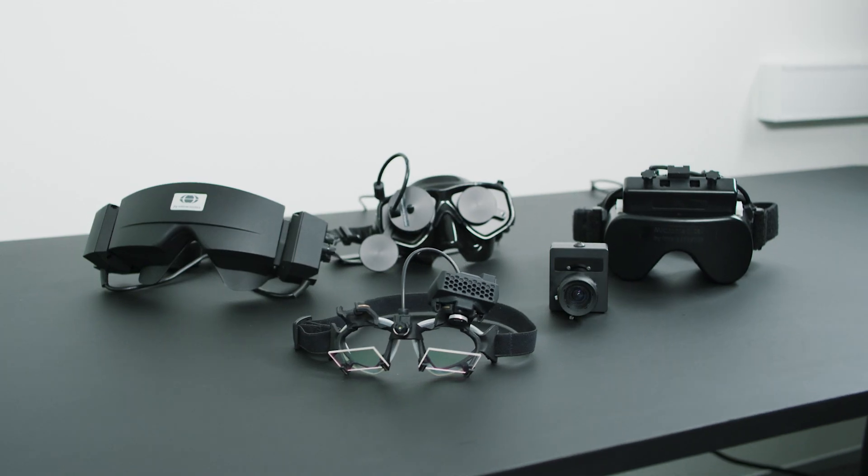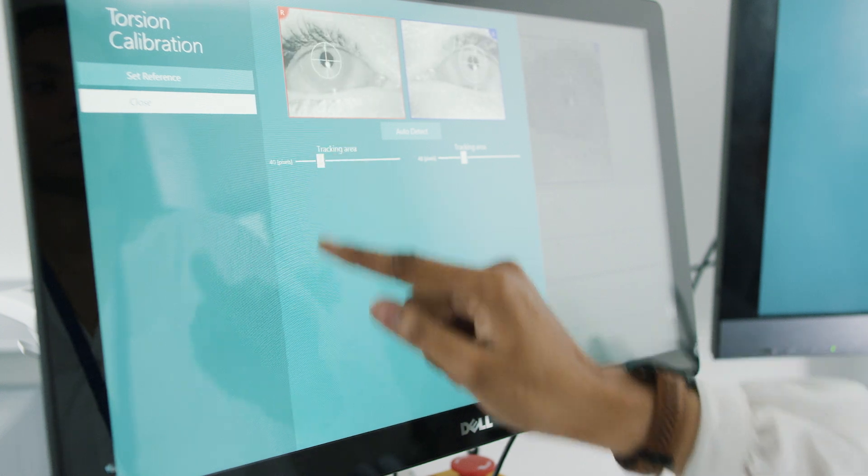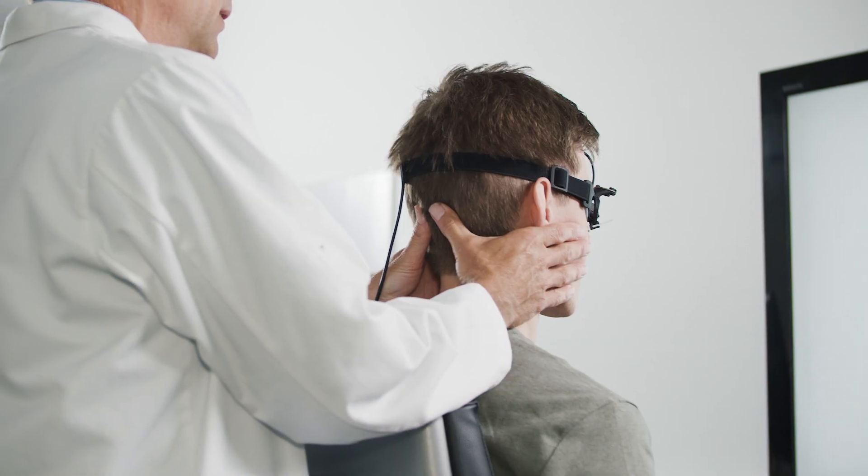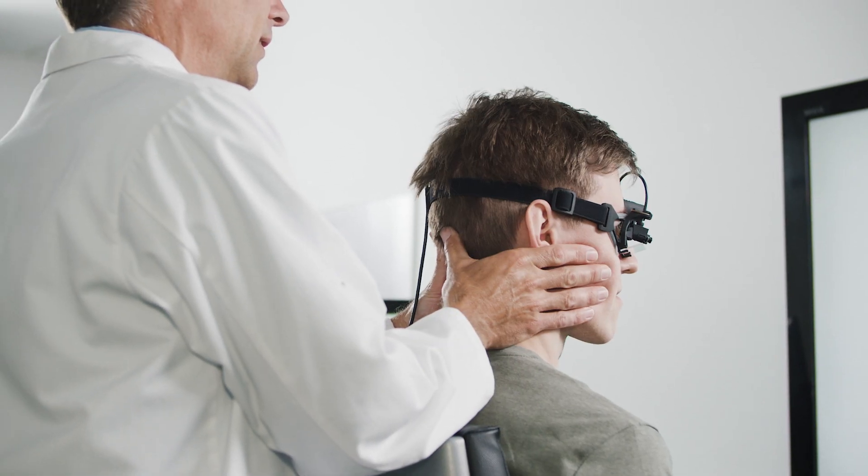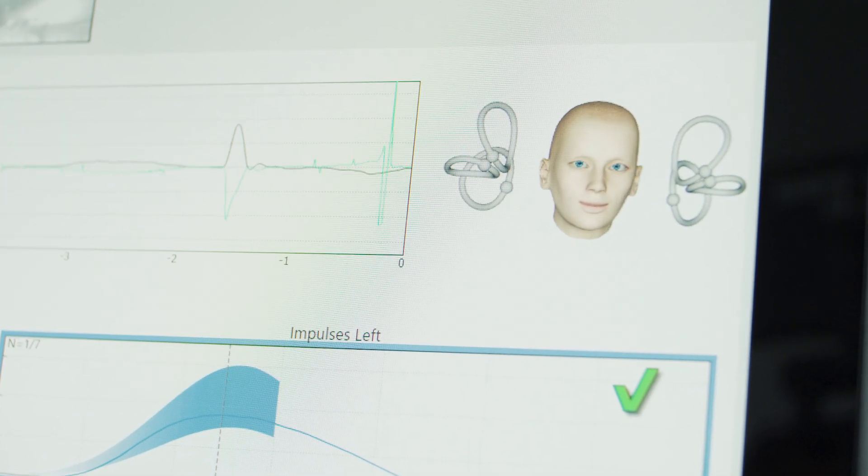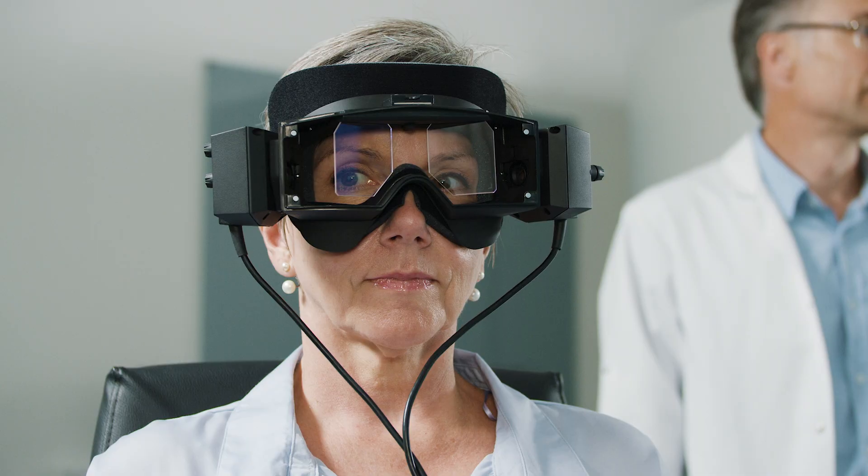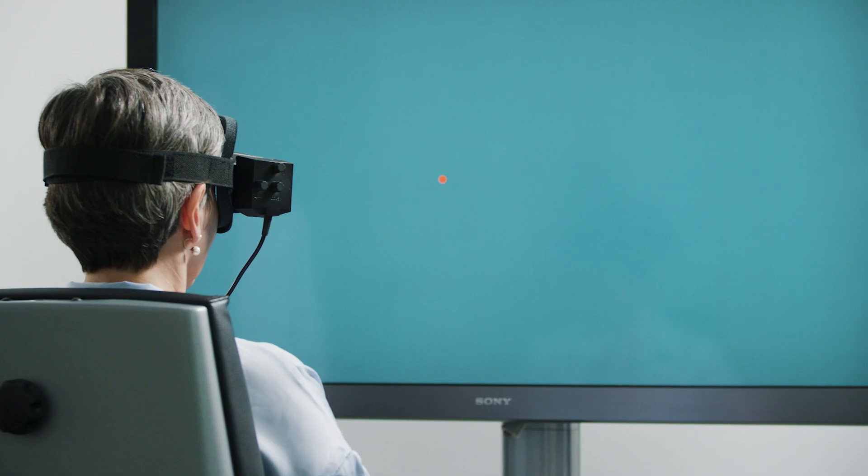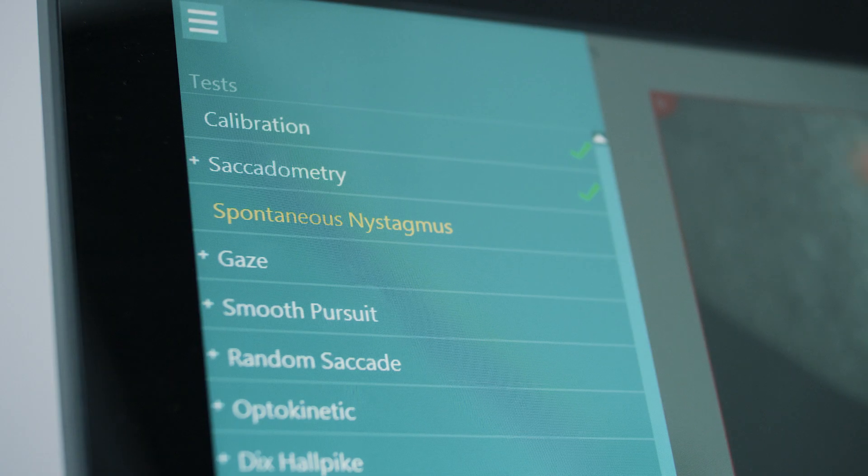Visualize includes features such as the new torsional algorithm and the 3D head model, which advances your Dix-Hallpike and VHIT testing. It also includes advanced oculomotor tests like saccadometry.